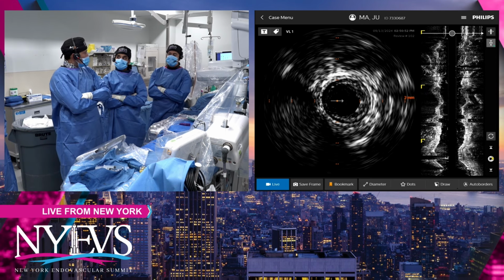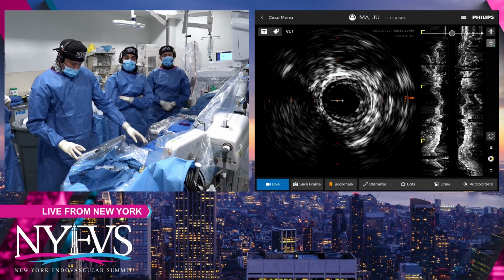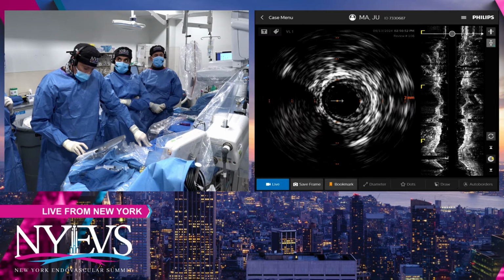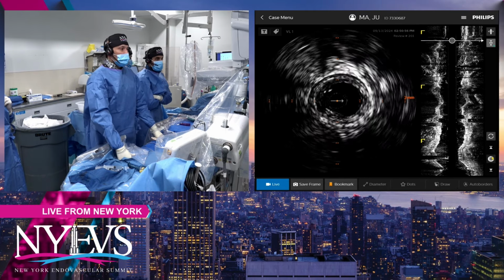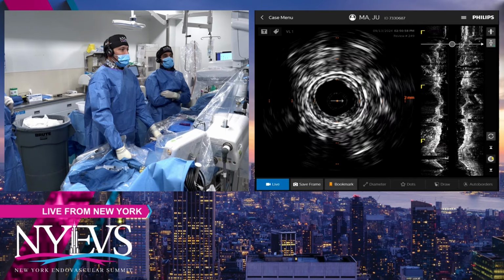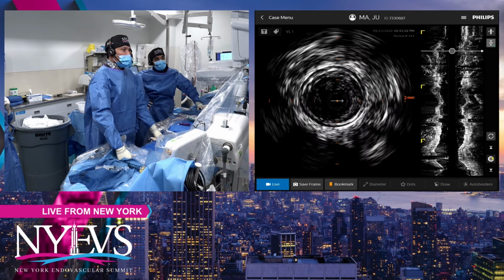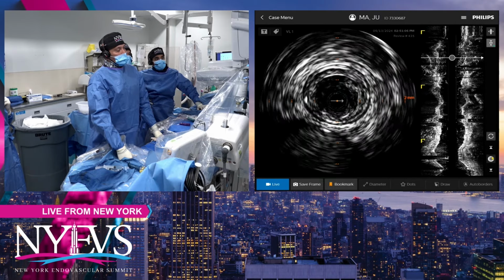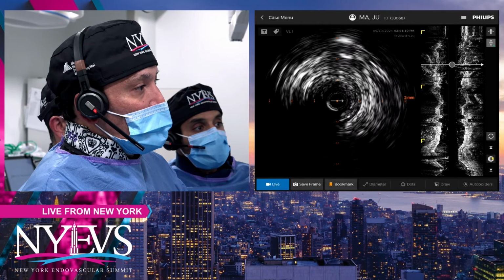All right, guys. Okay. Walk us through the IVUS. Yes, so we did an IVUS, and Karthik is going to talk about the IVUS. So we pulled it from the pop wherever the reconstitution is, and you can see the vessel size in the pop is pretty small. It's about 4.5 to 5. And then you see all the plaque and everything in the native plaque. This is all neoatherosclerosis as from what the information we have just after the stent.